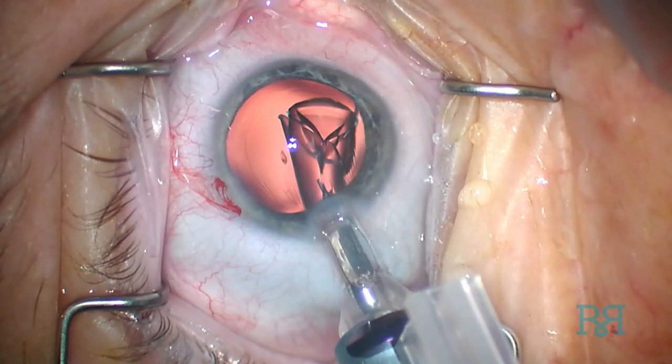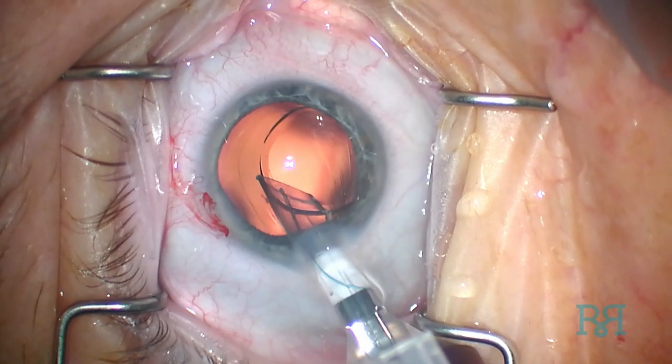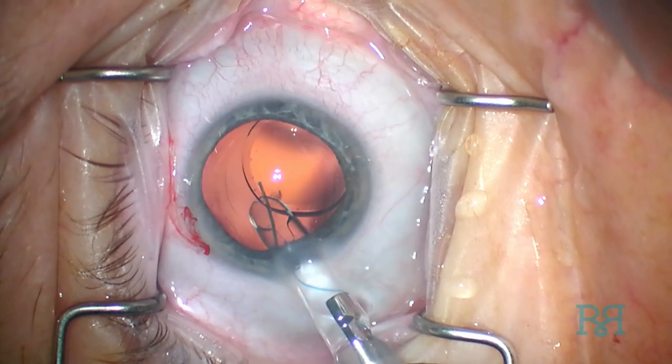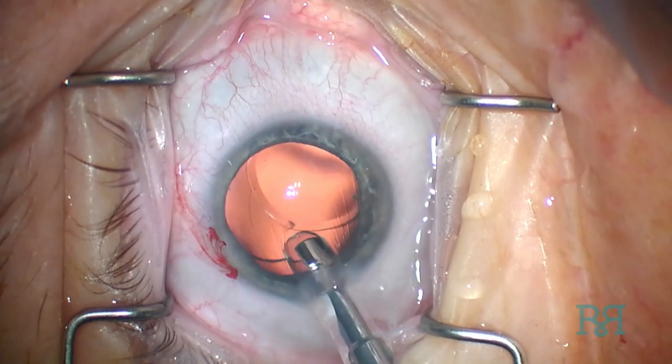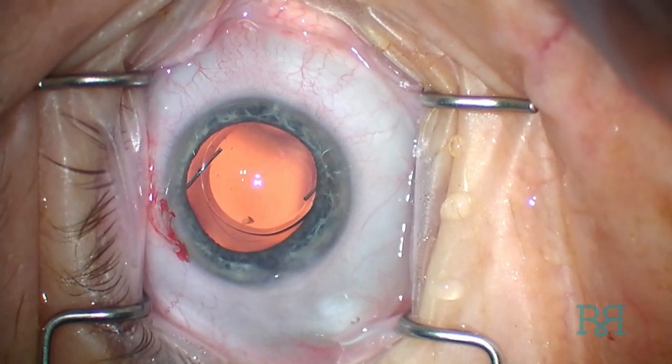It is important to note that there are two movements necessary in order to achieve an atraumatic insertion. One is rotation of the knob at the proximal end of the inserter, and the other is rotation of the entire inserter itself. These movements can be clockwise or counterclockwise.